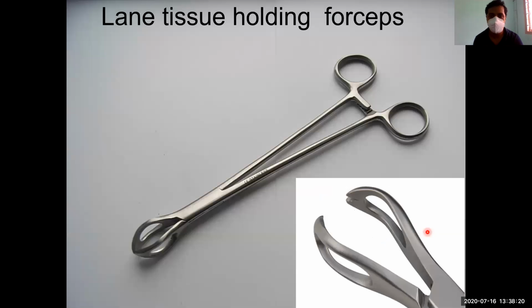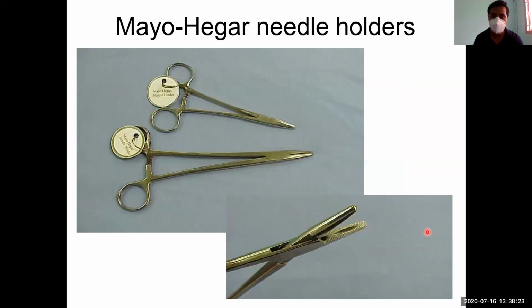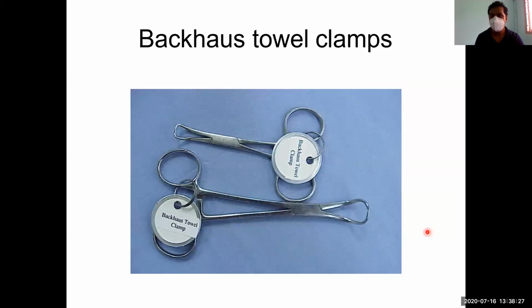So that is what we have discussed today: those instruments which are very common in almost all operation trolleys. I'm also running out of time, so we'll go through a quick review of the class so far. The towel clip is used mostly to hold the drapes on the area, so that the operation field is absolutely placed and separated from the other skin areas to prevent contamination. It can also be used as a tongue clip, a cord holder, and to hold wires in any kind of open operation and also laparoscopy. But you have to take care while applying this so that the tips do not cause damage to the wires.